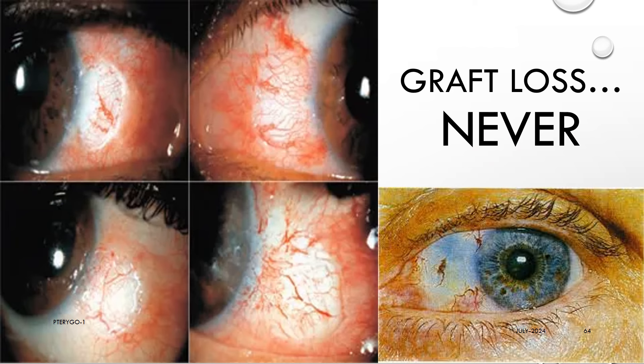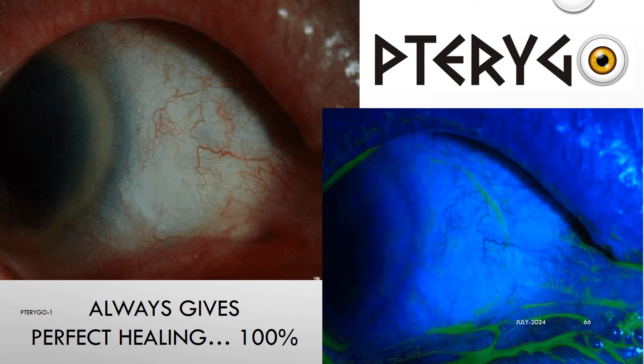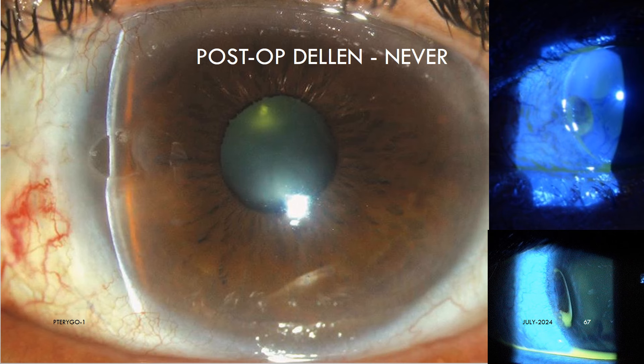Graft loss did not occur in any case and will not occur, because it cannot occur. The graft cannot move or escape from under the Pterygo BCL. The lens is large, almost touching from upper fornix to lower fornix, so it cannot pop out or fall out like normal 14 mm lenses. Lens loss or graft loss will never happen. The Pterygo always gives perfect healing 100%.